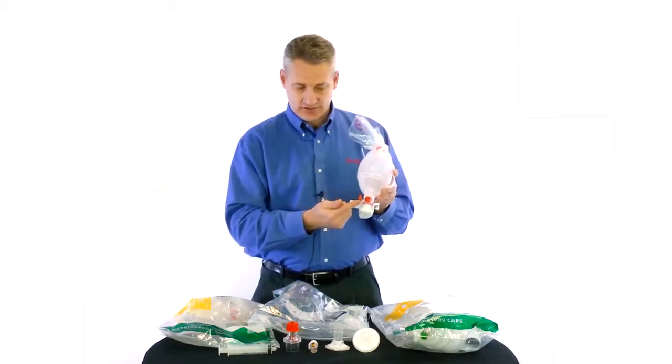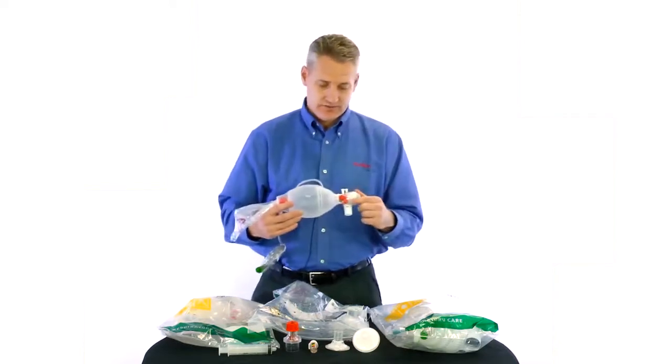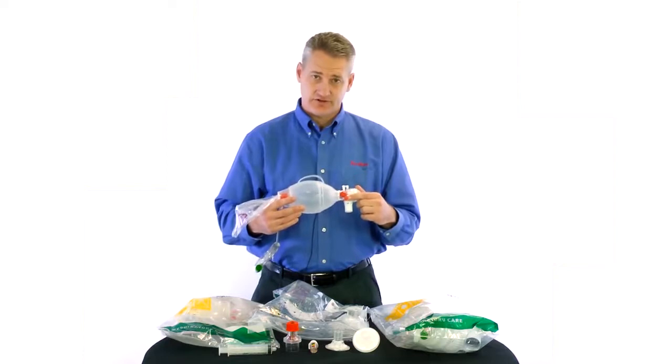We also have, just like on our adults, our medication delivery port, where you can deliver any type of cardiac care drug or pediatric care drugs through the resuscitator. You can also do ETCO2 monitoring through this port.